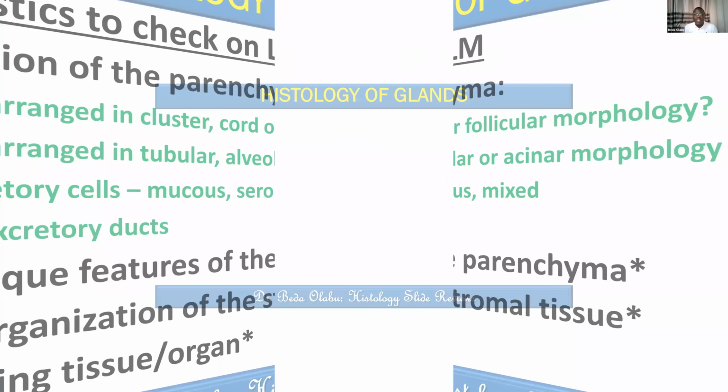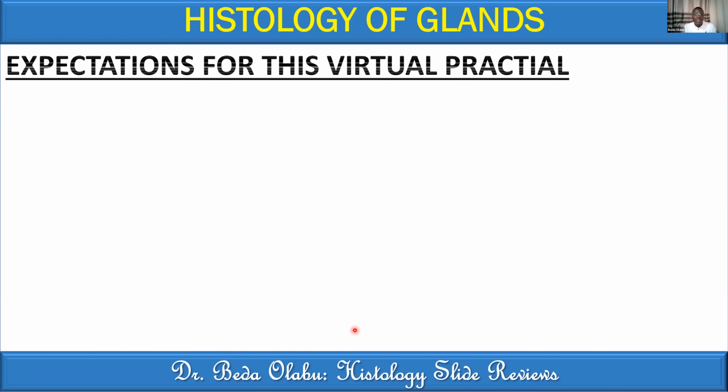So having said those many things that you talked about, I want to now look at specific slides with the hope that you are going to identify them and describe them. Or let me put it this way, you are going to describe them histologically and then identify them.